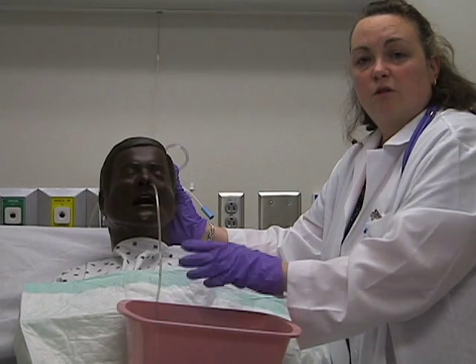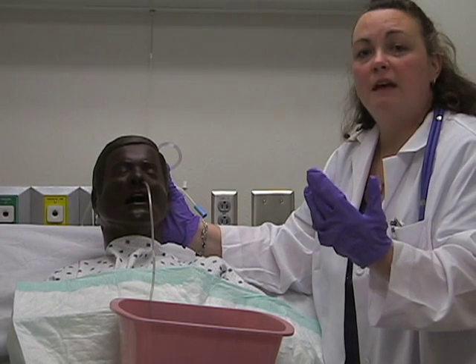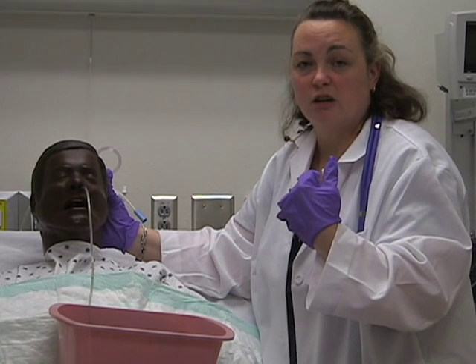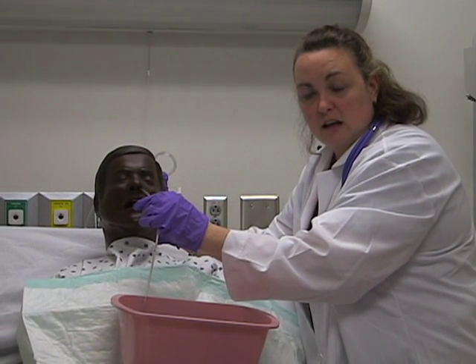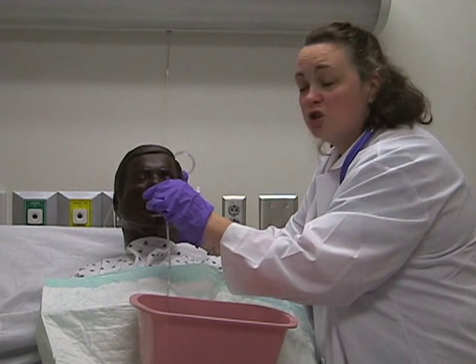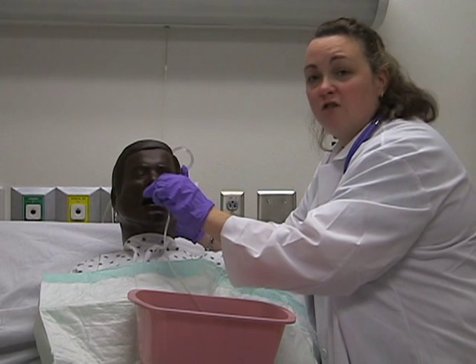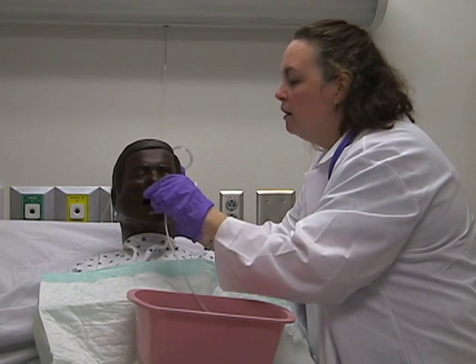When inserting the NG tube, there is a chance it may go down into the trachea. Symptoms include excessive coughing, the patient feeling like they're choking, turning reddish, or becoming cyanotic. If you see those signs, pull back on the NG tube until they can catch their breath, then continue inserting while telling them to swallow. For patients on fluid restrictions or NPO, you may need to physically instruct them — 'swallow, swallow, swallow' — to elicit the swallowing reflex.